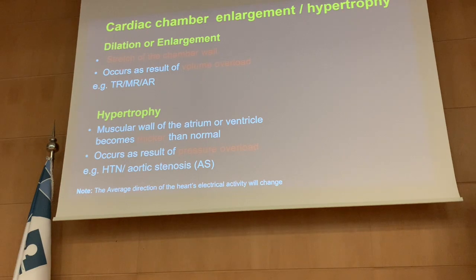That means there is... So the exam at 10, I'll finish. Easy exam. Okay. Easy. So that means there is something extra. So we have right ventricular dilatation.